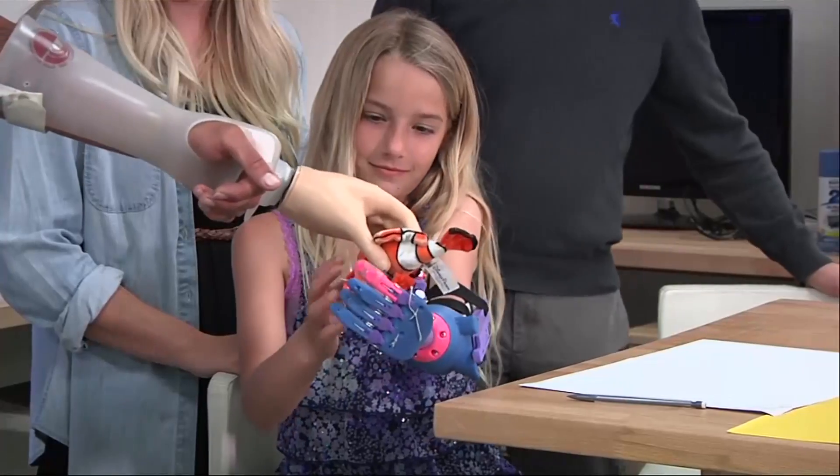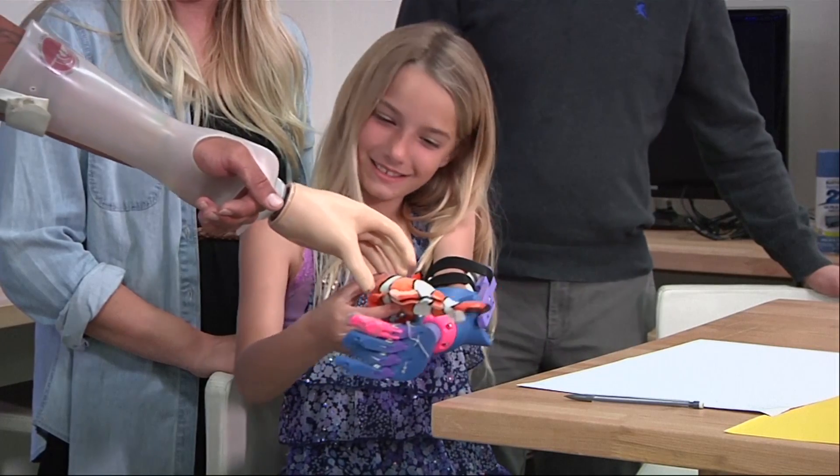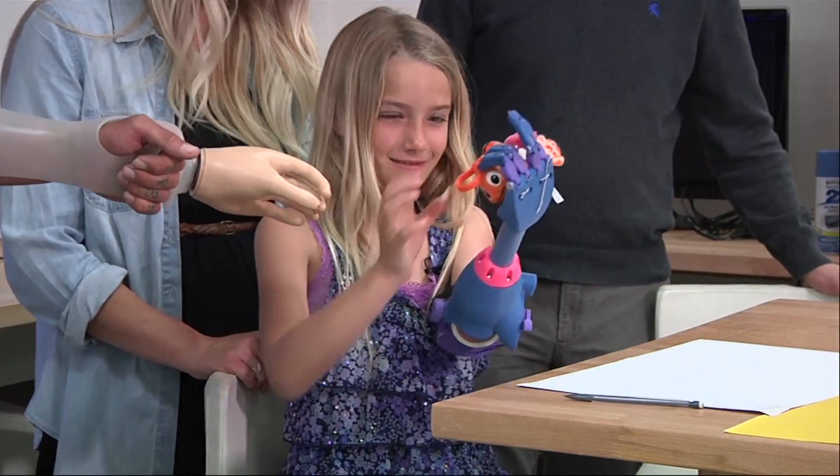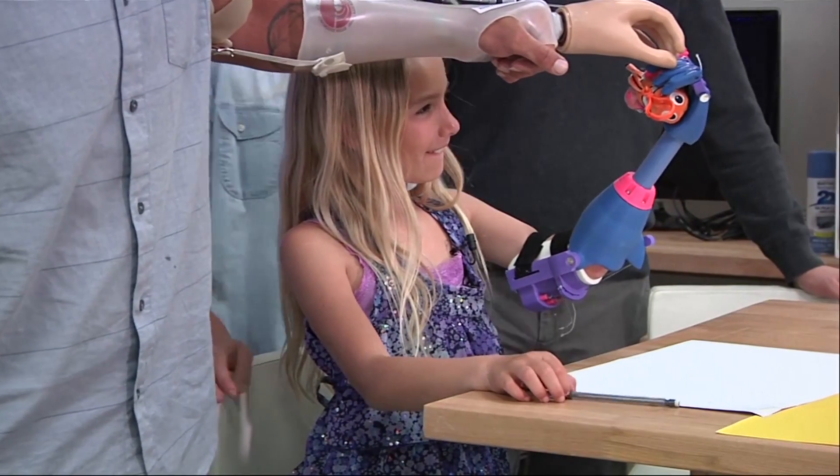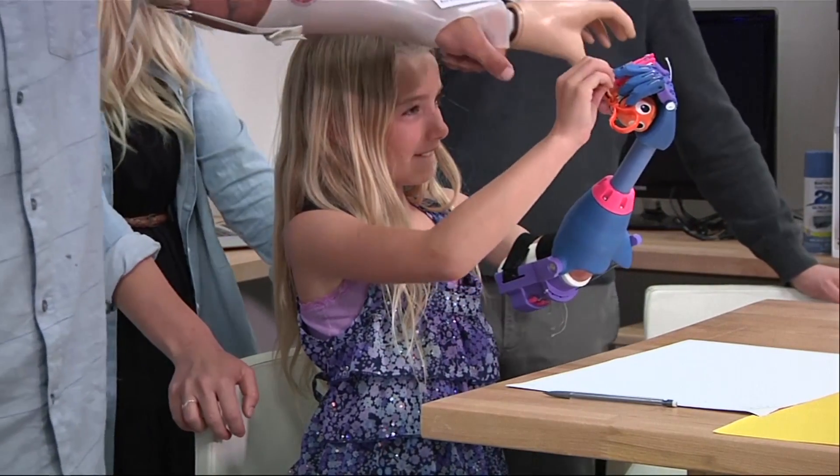It's been very emotional just to know how something as simple as this is going to change her life in a big way. How are you? Still getting used to it.